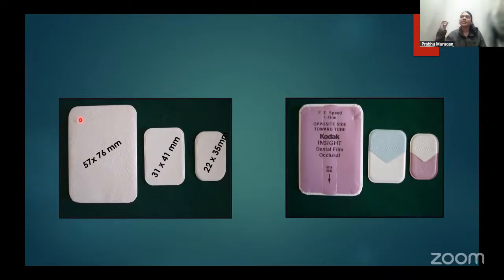Imagine your X-ray source to be something like a light. When you have a light, you need the object. When you need some shadow formation, you have the light source on one side, the object in between, and then you keep a wall or a paper on the other side to receive the shadow. Similarly, your X-ray source on one side, your object should be in between. The object is your tooth, and then you have your X-ray film. So the film has to be placed behind the tooth. Never place it on the buccal aspect. I've seen many people doing that, but never do that. The X-ray film has to be placed behind the tooth or the object which you're going to capture.